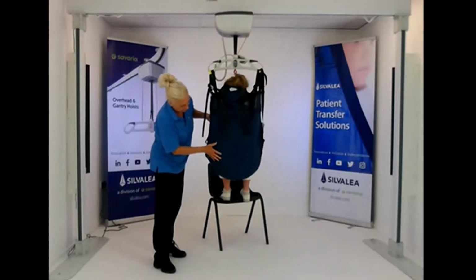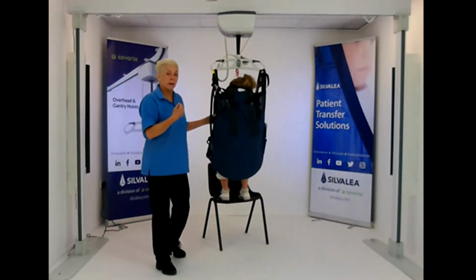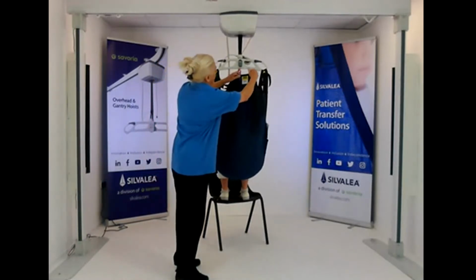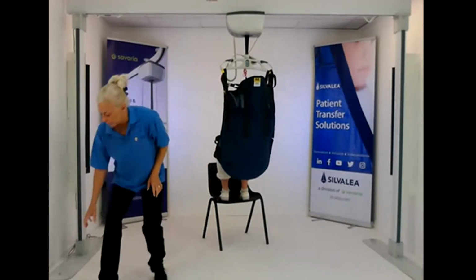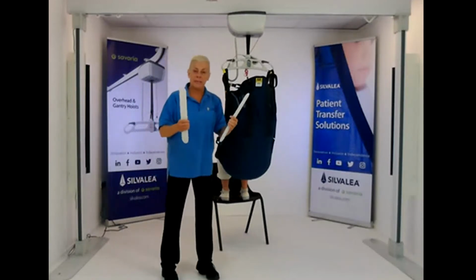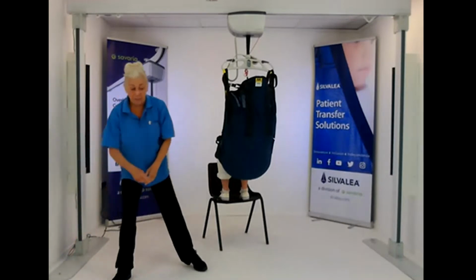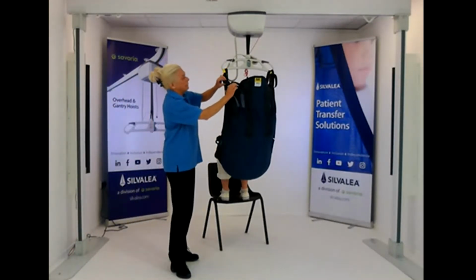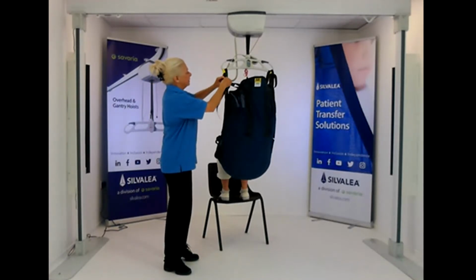You can see the sling is naturally hugging Laura. It's because it's got the nice soft stretch. Put your head back there. The head support there, I've taken out the bones. The bones look like this. And they slot in. But sometimes they can be too rigid and too stiff. So I've taken them out. And you need to take them out for laundering as well. But you've got a head support tape here. So it will support the head without the bones in.